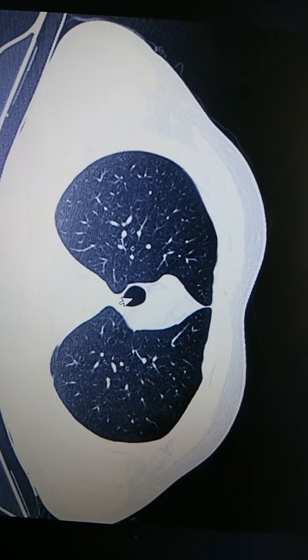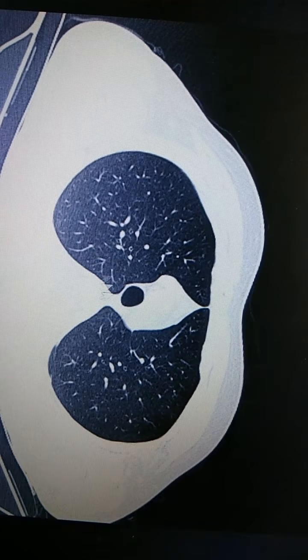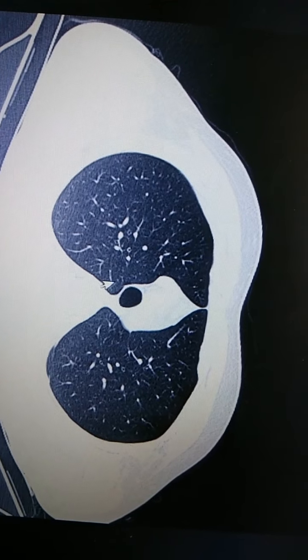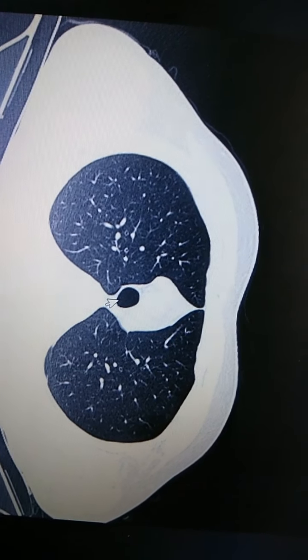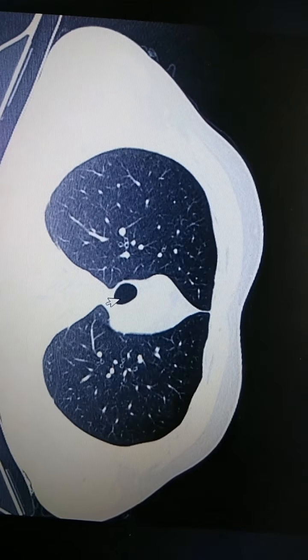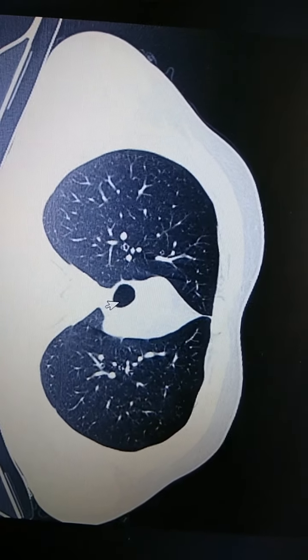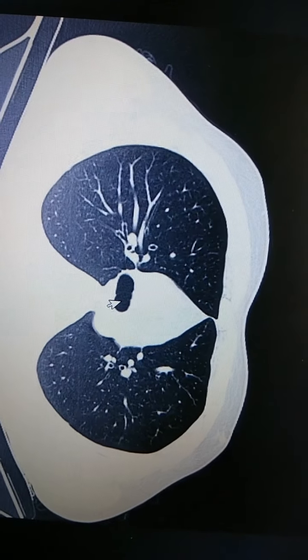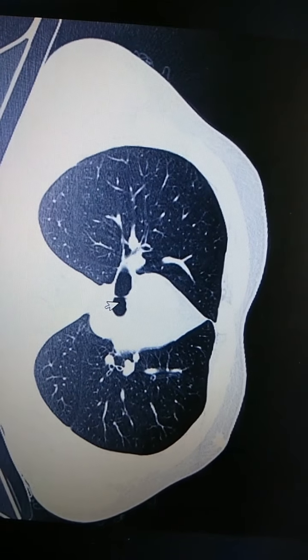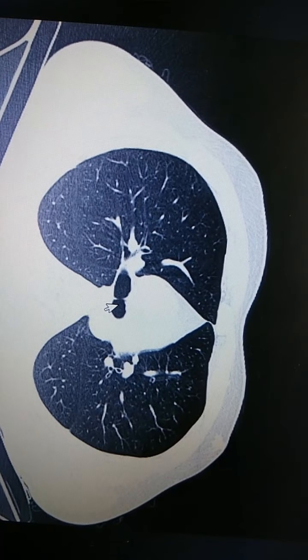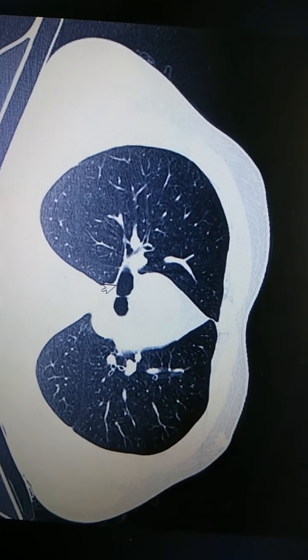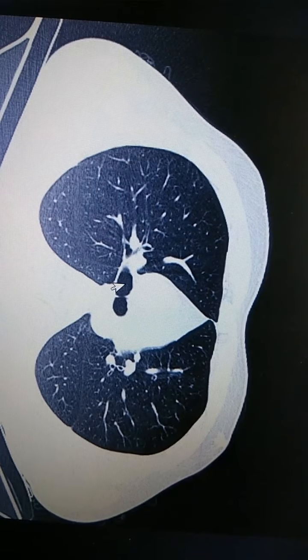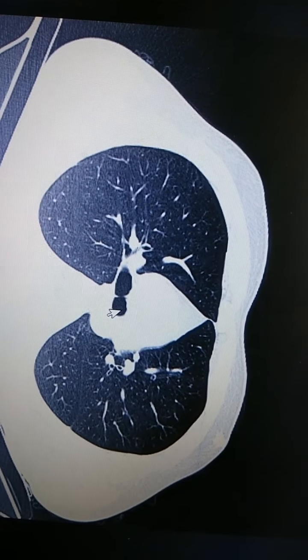This is the carina and trachea, and these are the 2 lungs. As we go down, the trachea gets divided into 2 principal bronchi — there is a right and a left. As you can see, this is the right side and this is the left side.